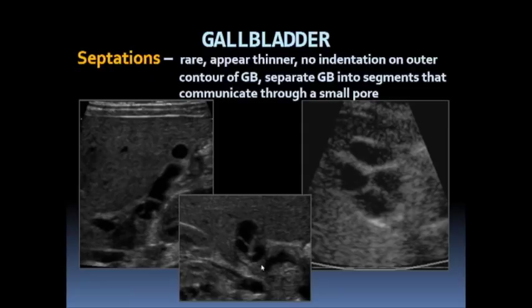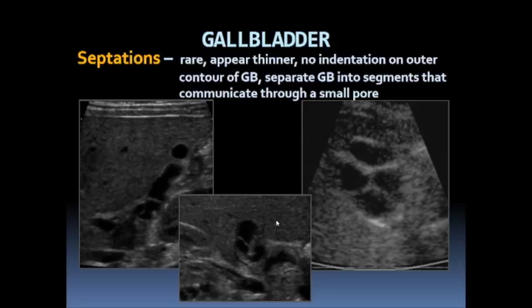Unlike folds, septations are rare, they appear thinner, and there's no indentation along the outer contour of the gallbladder. Septations separate the gallbladder into segments that can communicate through small pores. Illustrated are longitudinal and transverse images of a gallbladder containing multiple septations.